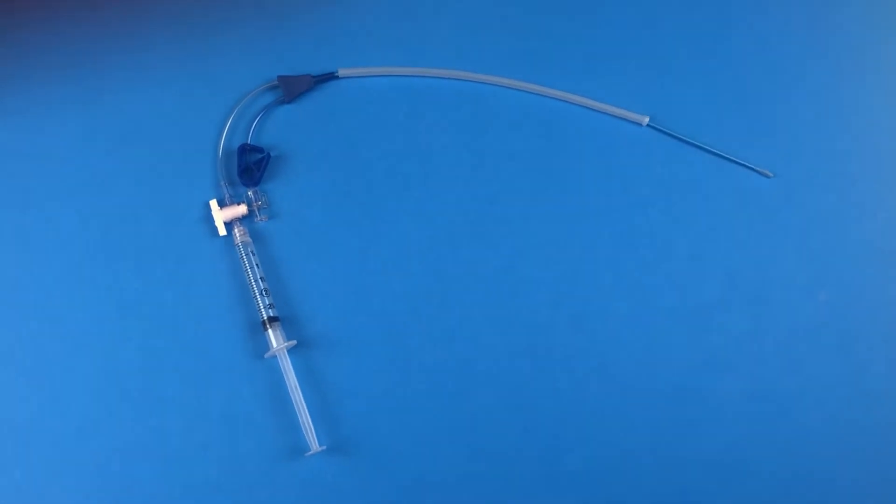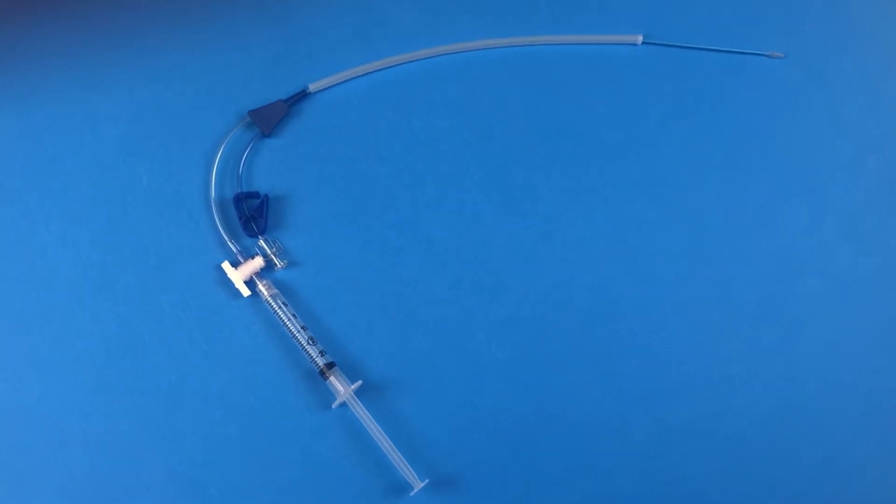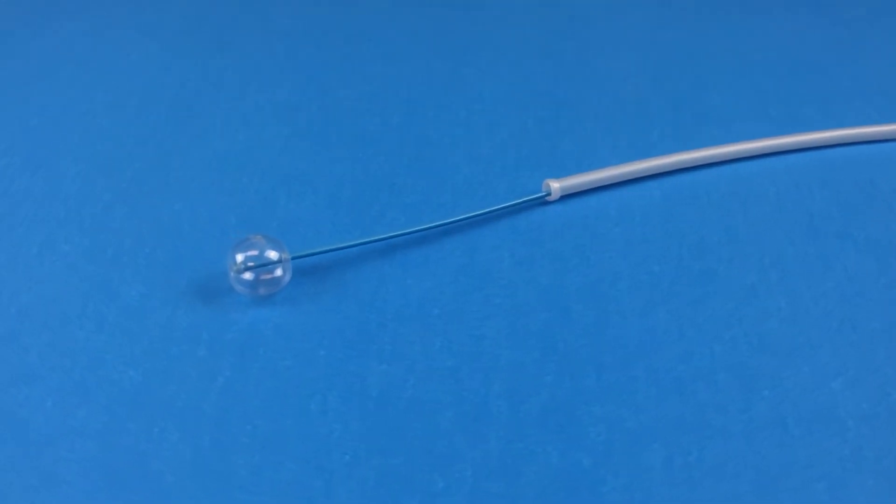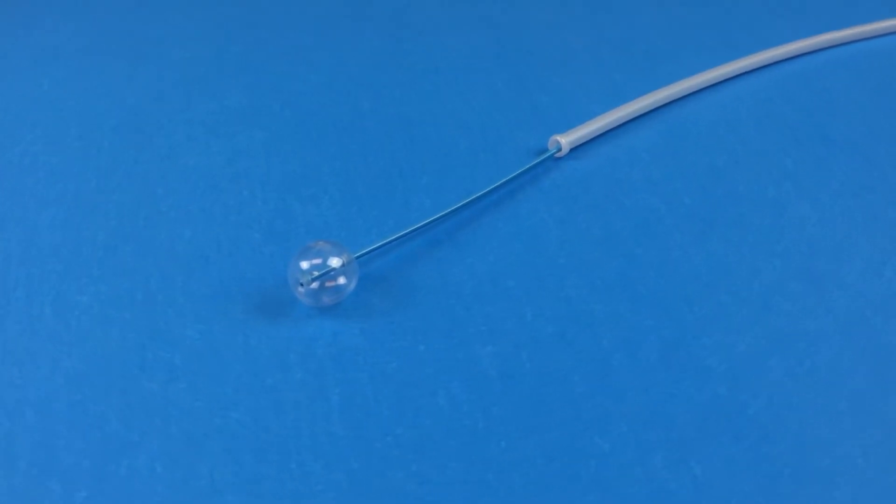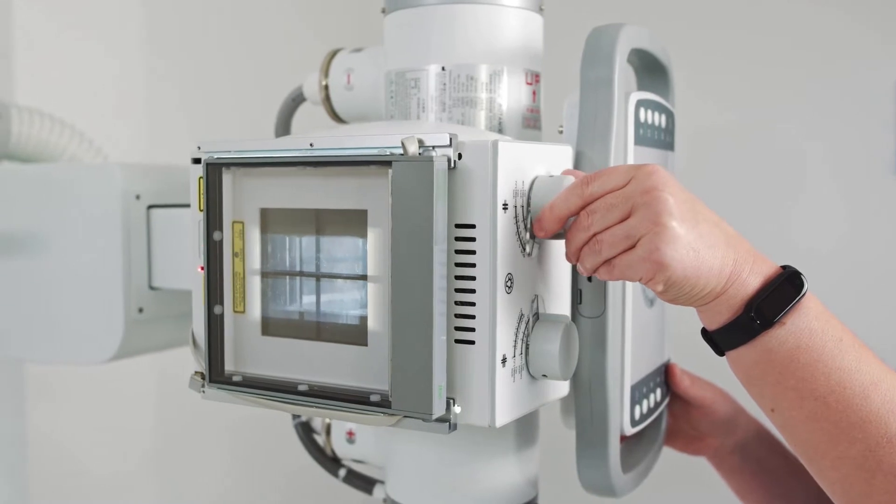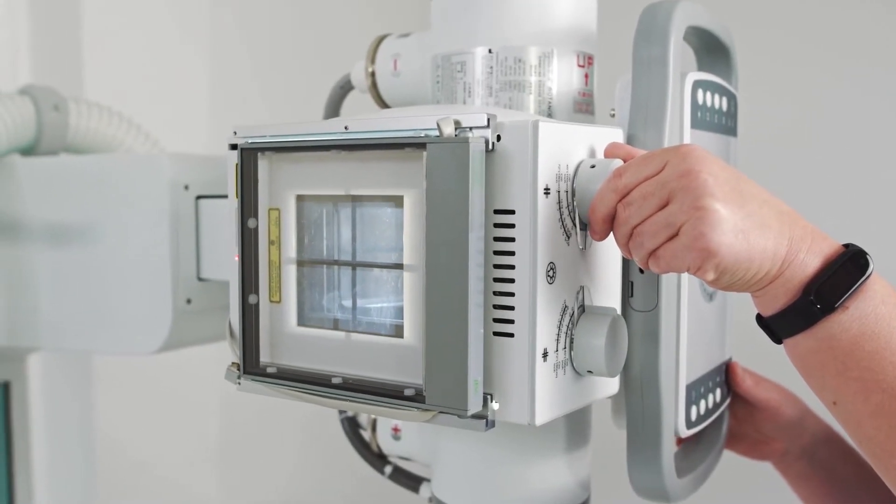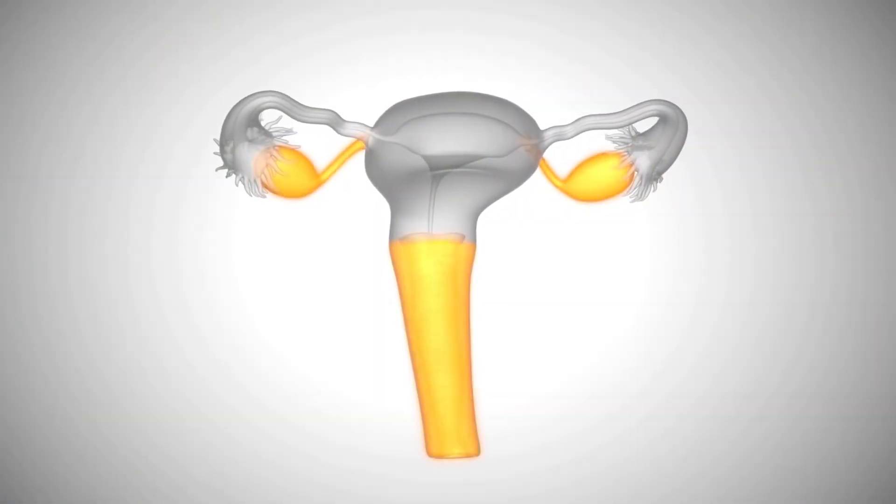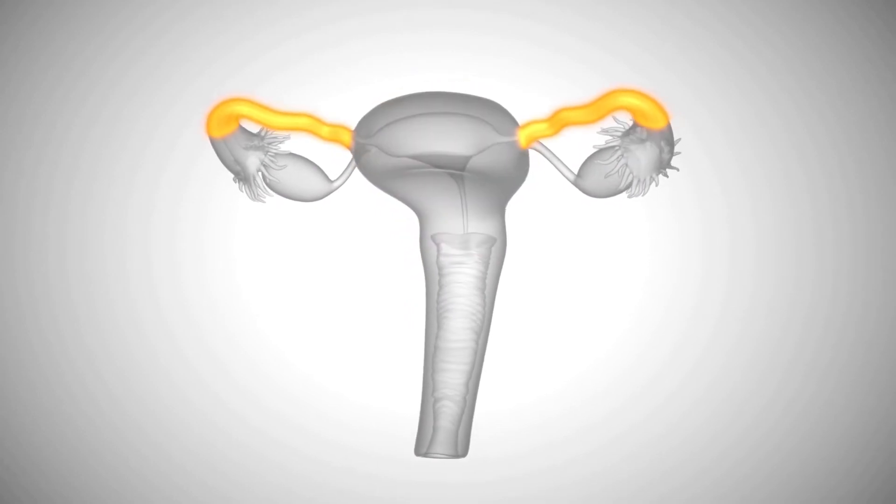This is the Thomas Medical flexible HSG catheter. The catheter is used in hysterosalpingography or sonohistography procedures, HSG or SHG for short, which visualize the uterine cavity and fallopian tubes.